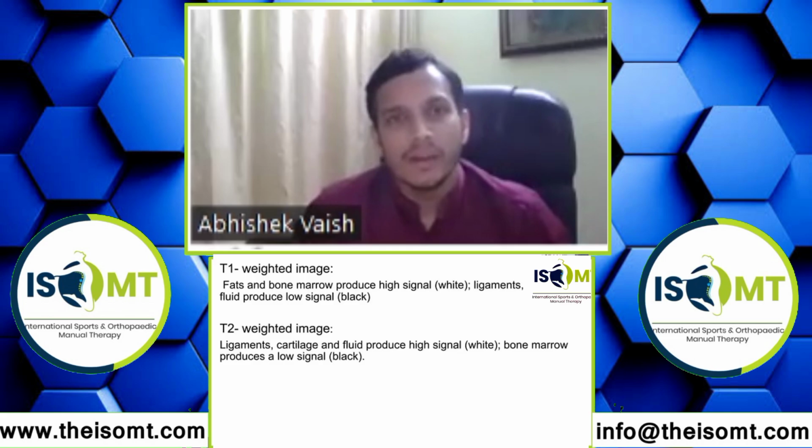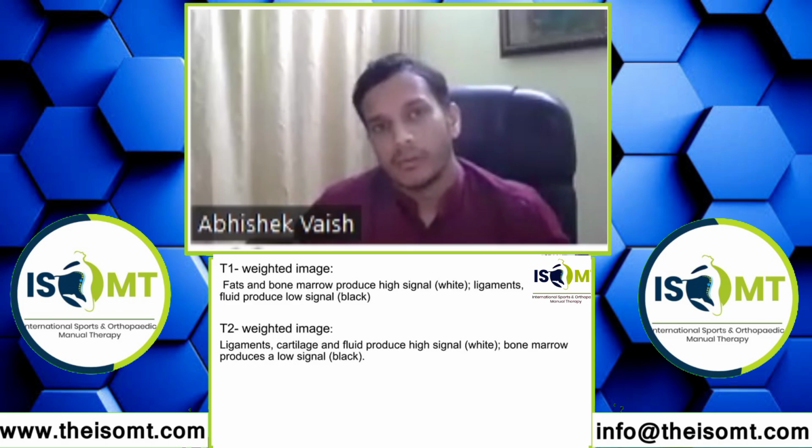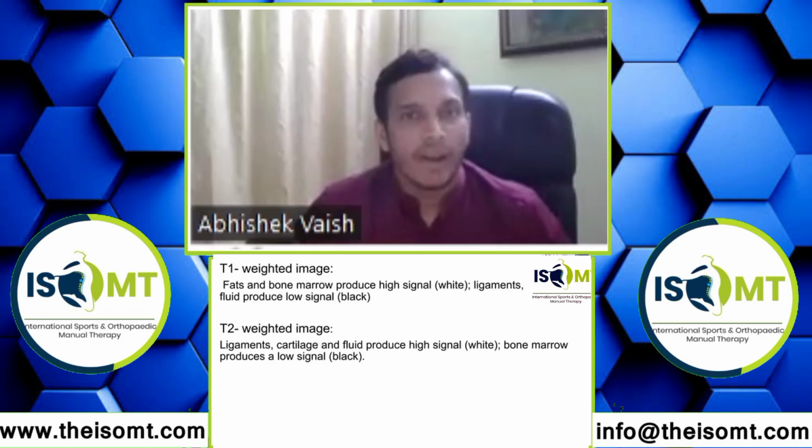So what is the easy way to remember it? It is very confusing. So the easy way to remember is World War II. In a T2 weighted image, water will show white. The T2 image will show water white. And T1 images are mainly used to see normal anatomy. So if you remember these two things, it will be easy to remember.